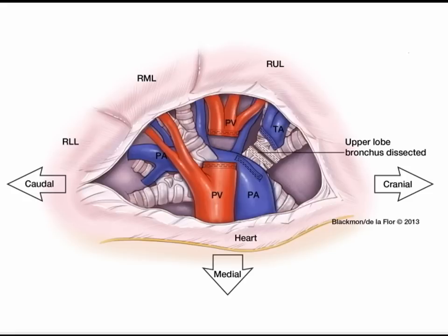Now you have divided all of your hilar structures going to the right upper lobe — the bronchus, the artery, and the vein. All that remains is the fissure, which is stapled from the utility port beginning anteriorly towards the posterior area and angling upwards to preserve the superior segment of the right lower lobe. Once the fissure has been divided, the specimen is placed into an endocatch bag and removed through the utility port.